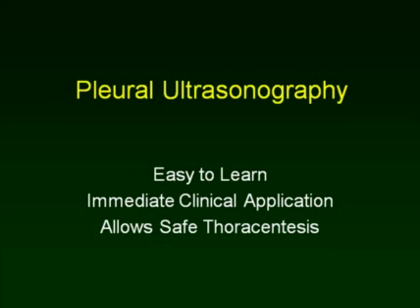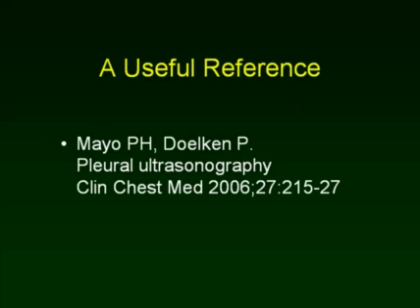Pleural ultrasonography is a key skill for the intensivist, also for the EM clinician. It's easy to learn, has immediate clinical application. It allows safe thoracentesis. A useful reference might be a recent clinical chest medicine review on the subject. You could take a look at that.